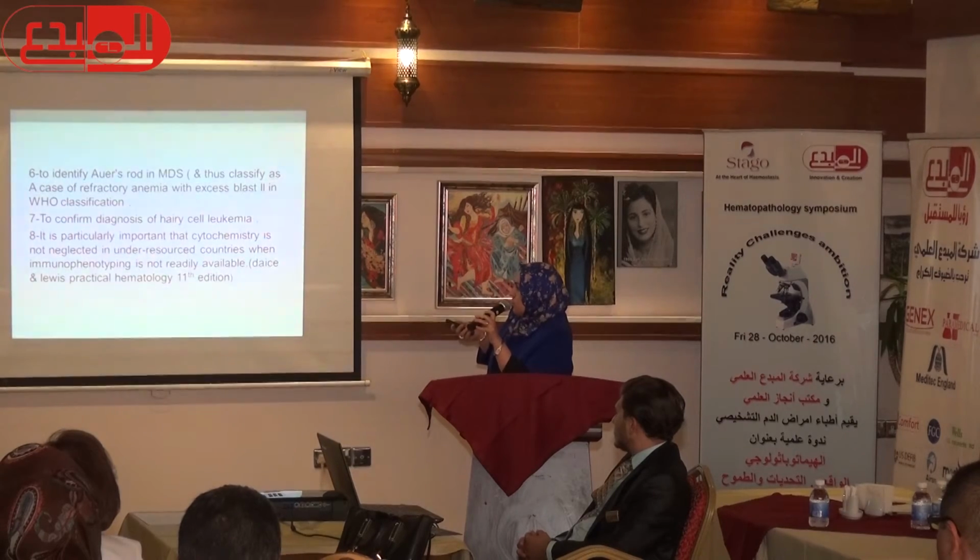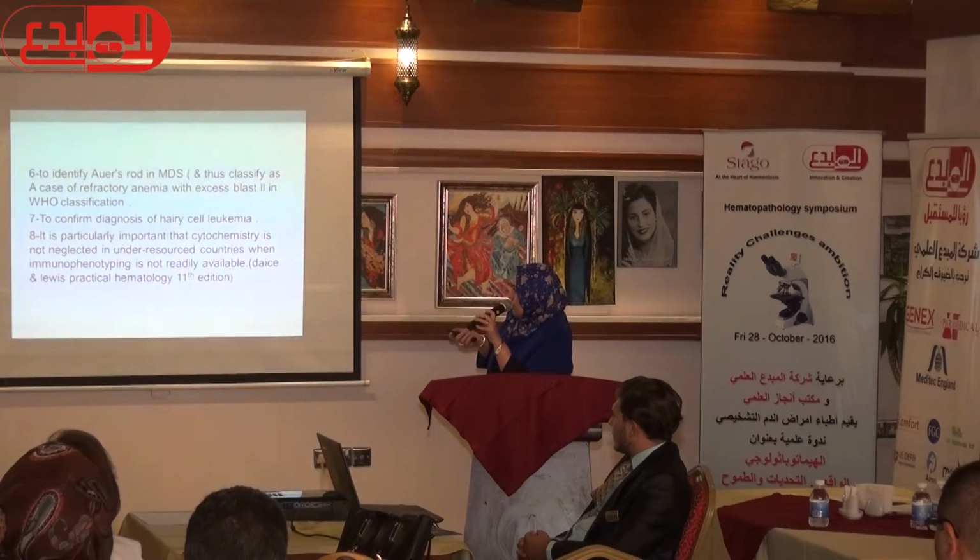Cytochemistry is also used to confirm diagnosis of hairy cell leukemia. It is particularly important that cytochemistry is not neglected in under-resourced countries when immunophenotyping is not readily available. This is the situation in these countries.